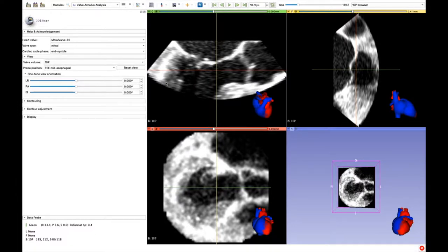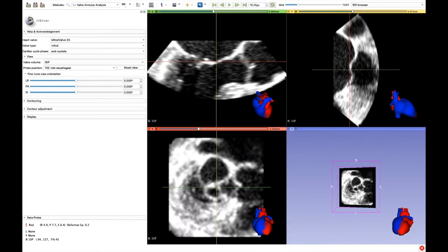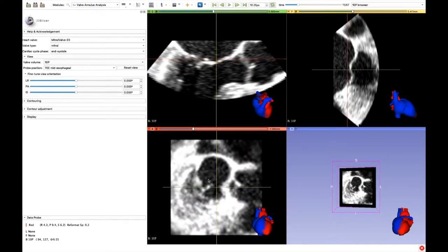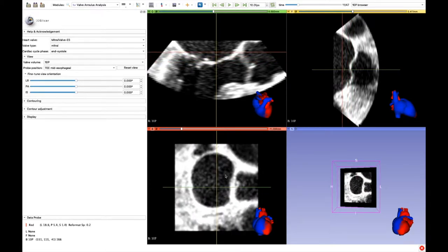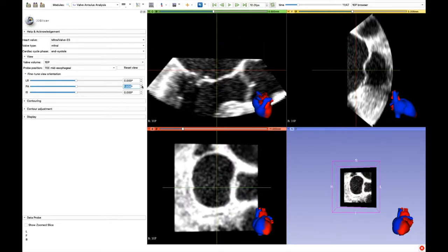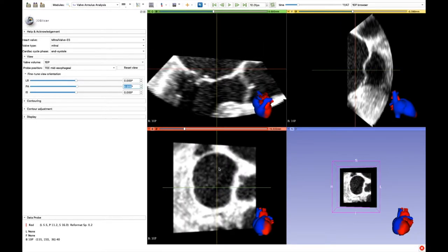The next task is to align the red plane parallel to the annulus plane. Scrolling the mouse wheel while the mouse cursor is on a panel will cause the movement of the corresponding plane. The controls on the sidebar can be used to fine-tune the orientation of the image.